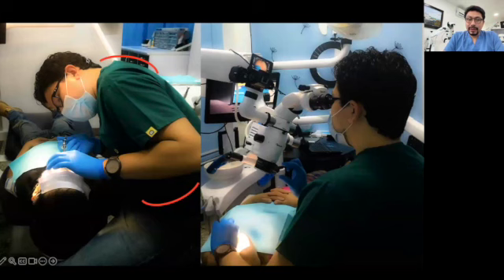See my position. I have this clinical position for applying anesthesia in the palatal zone in a little kid. That picture was taken maybe 8 years ago. And with the microscope, if you have the rotational extender accessory, you can do the same.